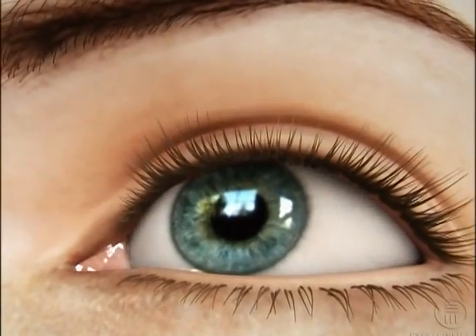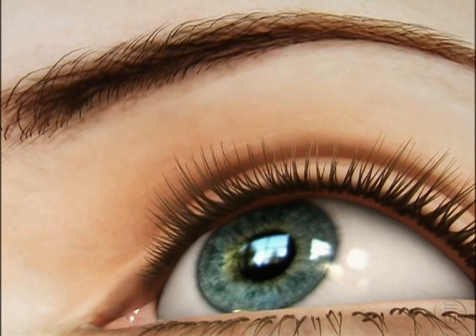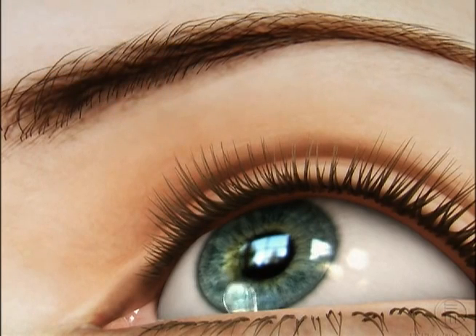If you are diagnosed with narrow-angle glaucoma, your doctor may perform a procedure called laser iridotomy to decrease the risk of a sudden and dangerous buildup of pressure in your eye. Before the procedure, your doctor will place drops in your eye to constrict the pupil.